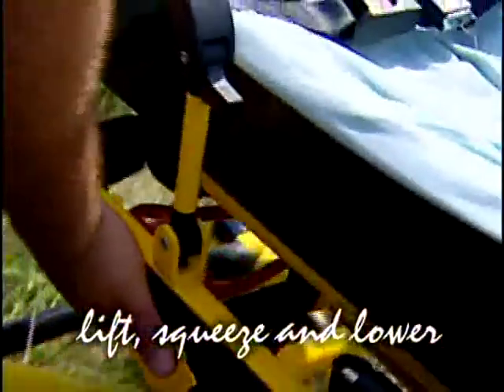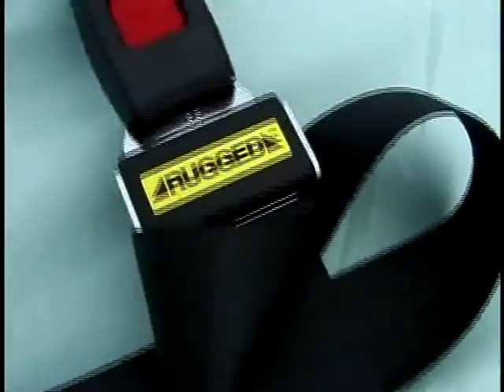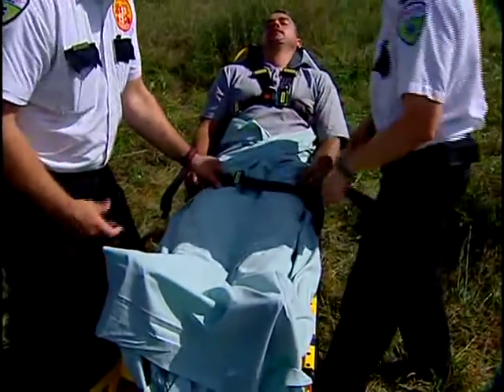If your partner's tied up, you can lower the cot yourself without a struggle. When it comes to securing the patient, the MX Pro's safety restraints fasten easily across the chest and can be placed at different positions along the litter frame to fit the patient.